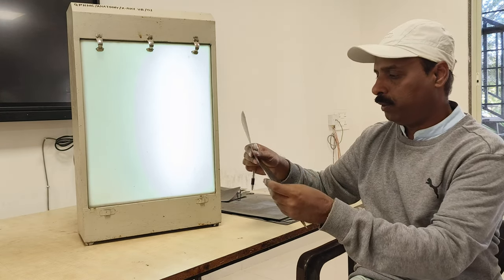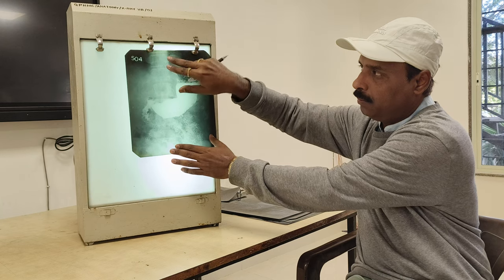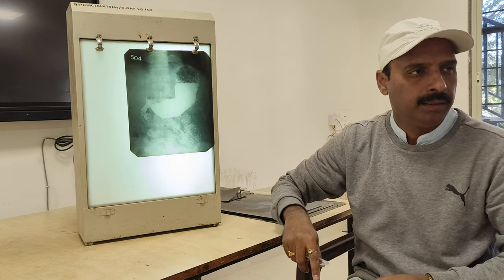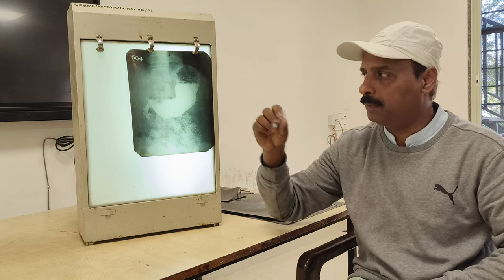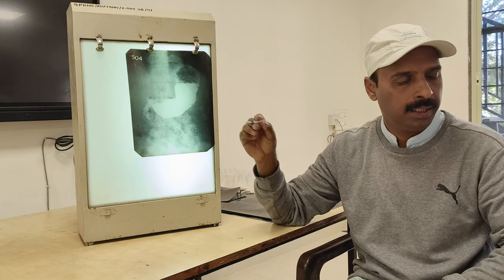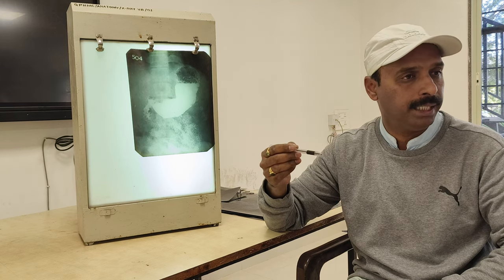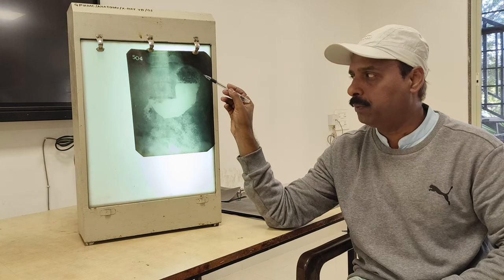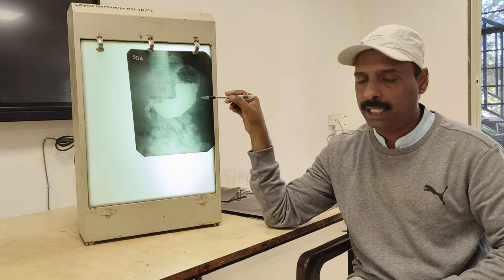Then the second type, which is important and which you should remember, is the contrast x-ray. I have shown you almost all the study of the plain x-rays. Now the second type comes, the contrast x-rays. Here radio opaque media are used, and after that we take the x-ray, and these radio opaque media give the shadow on the x-ray film. So this is the x-ray shown.